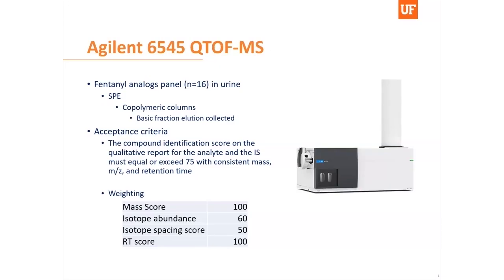As previously mentioned, we are mainly a GC-MS laboratory, but we are fortunate enough to have acquired an Agilent 6545 several years ago. When I first started at the lab about 2.5 years ago, there was a method on the QTOF used to screen for carfentanil cases. The panel consisted of 8 fentanyl analogs, including carfentanil and fentanyl. During this time, fluorofentanyl was just beginning to reemerge in prevalence throughout the country. One of my first tasks was to use retrospective analysis to presumptively identify if previous cases had fluorofentanyl or xylazine present. After this observation was complete, we revalidated the method to identify fluorofentanyl, xylazine, and 14 other fentanyl-related drugs in urine.